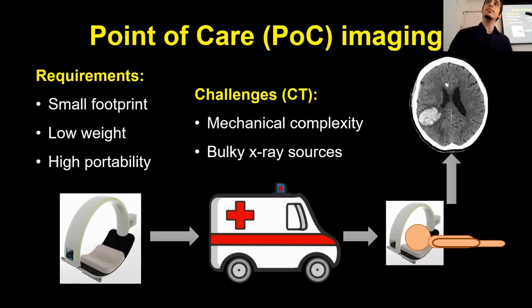It's very interesting that you are trying to design and optimize the system. I was wondering if you ever thought about the other components in the chain, for example, data calibration and reconstruction. You show images here. How do you get them? What reconstruction approach are you taking? That is a huge variability as well. Thank you for the question. Very interesting question.